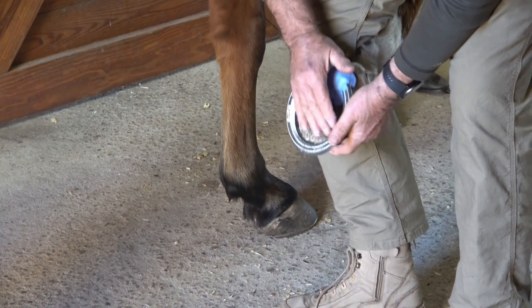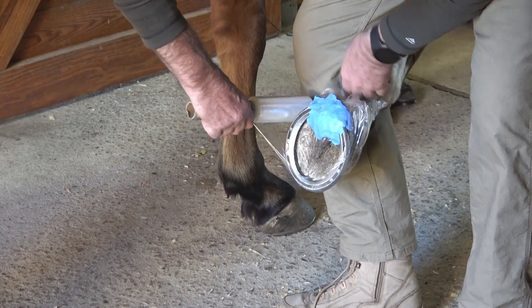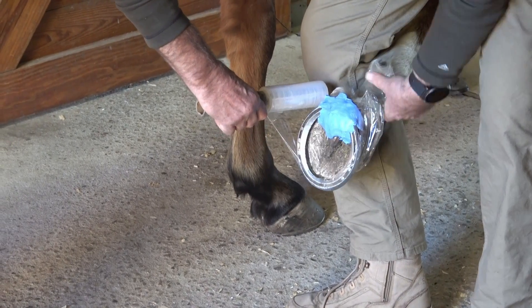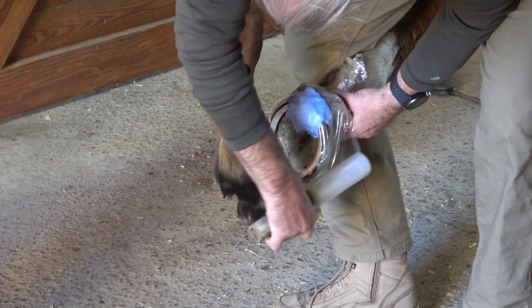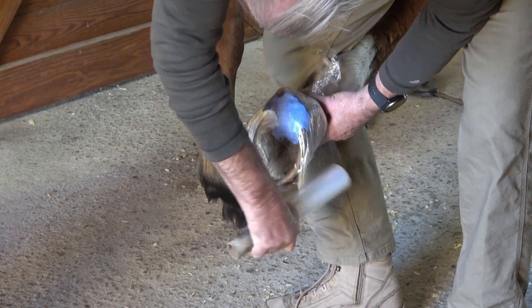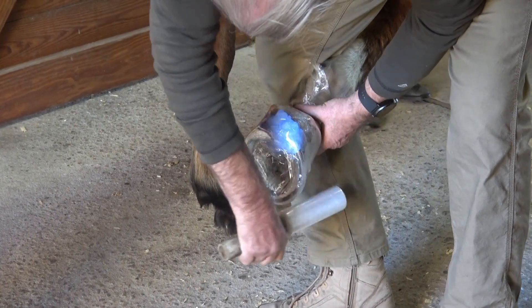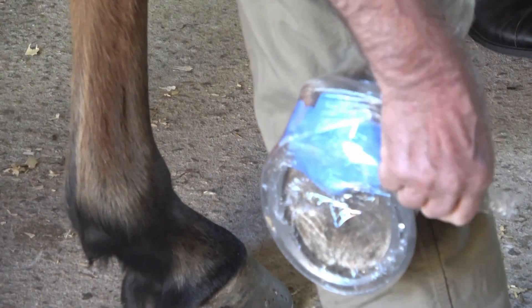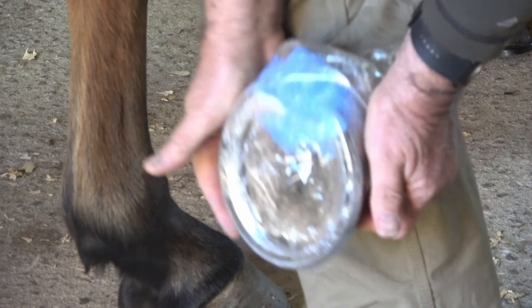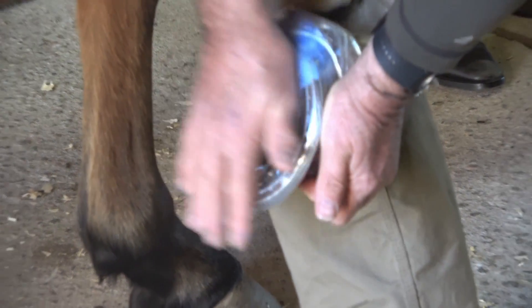To allow the material to cure, plastic wrap works as a great option. Start with at least one good wrap up over the heel bulbs to keep it from sliding down, and then go around the foot several times. Once the foot is wrapped, you can smooth out any high spots and continue to shape the material before setting it down.